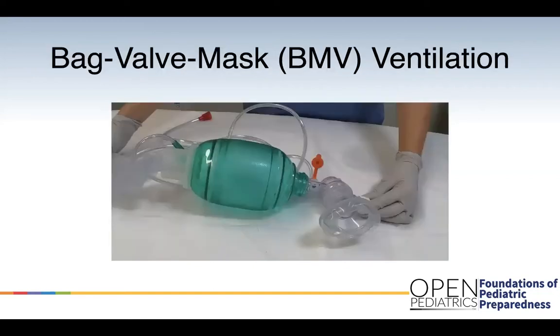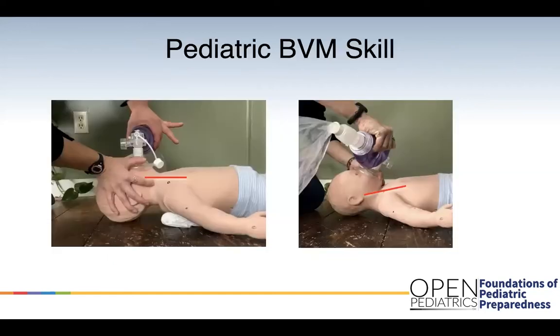For the purpose of this course, we are going to focus on the skill of bag valve mask ventilation. Excellent bag valve mask ventilation skills can be life-saving for a child in distress. When teaching bag valve mask ventilation, it is important to review 3 things: positioning, seal, and ventilation.